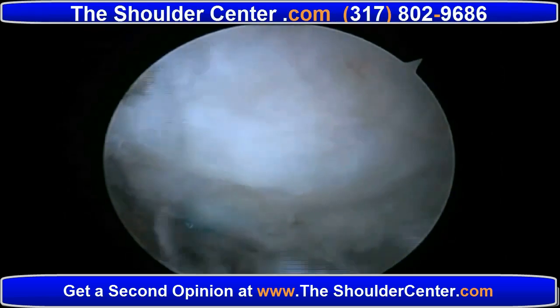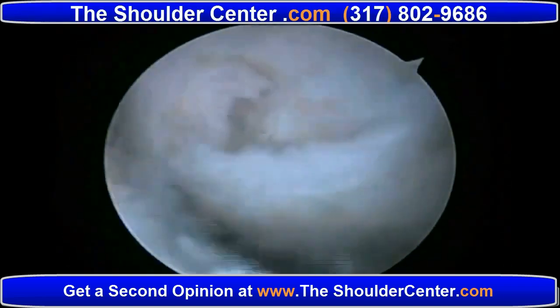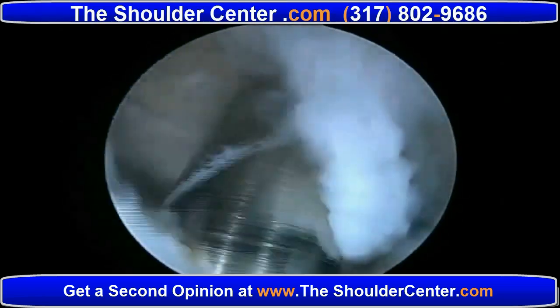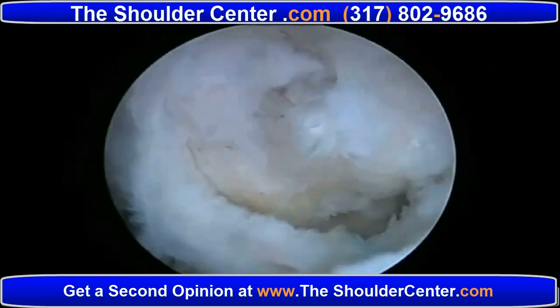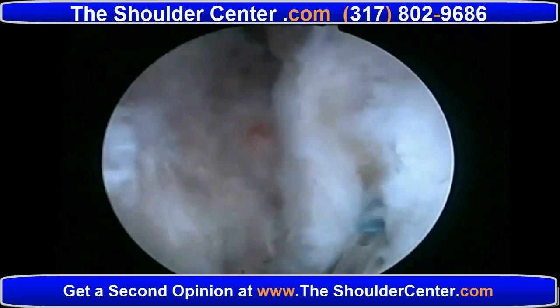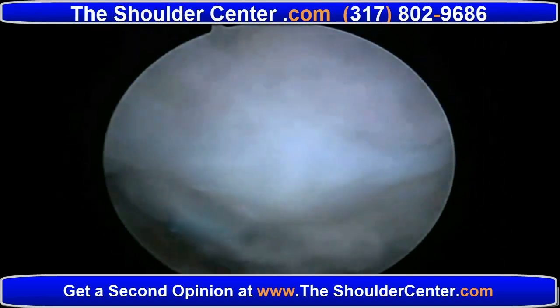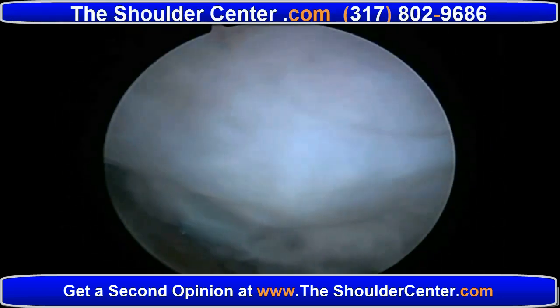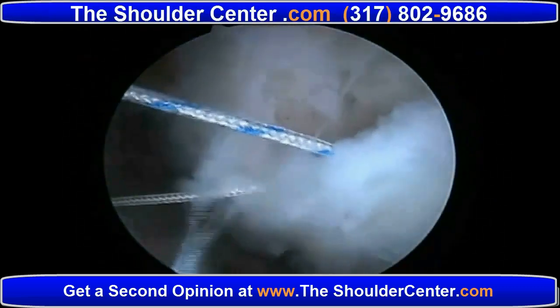Those familiar with our techniques know that we prefer a transosseous tension band rotator cuff repair technique. Initially, we drill the transosseous tunnel that's perpendicular. This 2.9mm socket is drilled at the medial aspect of the footprint, and the tunneling device is used to pass this green ethabond shuttle suture. For this repair, we'll pass two permanent braided sutures through the tunnel. Here we're looking at the healed graft that's fully incorporated and has given us a better quality rotator cuff tendon to work with.